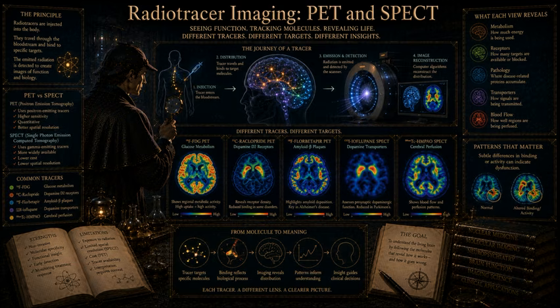Absolutely. To solve this, engineers developed solid-state silicon photomultipliers, or SiPMs, which use semiconductor microavalanches and are completely immune to magnetic interference. They are rapidly becoming the new gold standard. So whether by vacuum tube or solid state, the scanner registers these millions of electrical pulses. In a PET scanner, it finds the coincidences and draws millions of lines of response crossing through the brain. The computer stores all this geometric line data in a vast, complex numerical array called a sinogram.